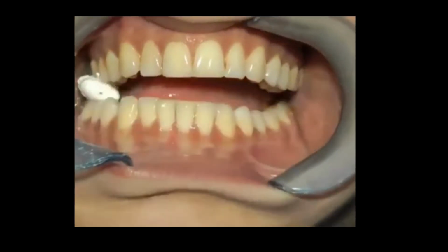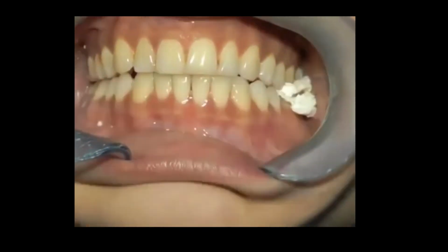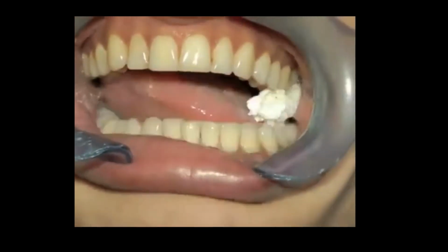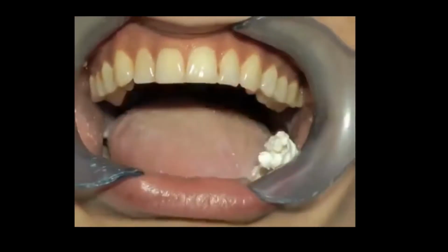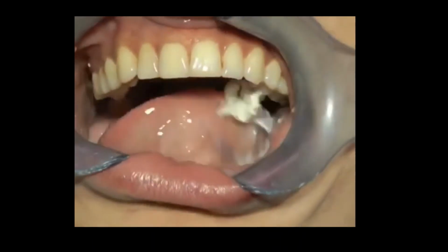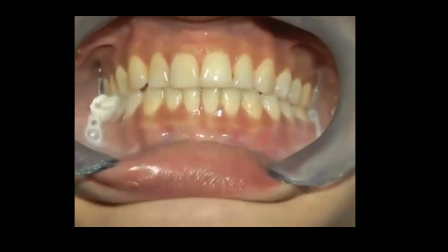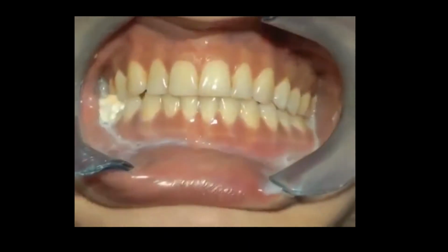And in this video, look at the rotation here. It's a little bit oval. You can actually see the freedom where they touch together, slide over, and then open. It's really dynamic here that you can see the freedom in Centric. And the teeth are designed with that motion in mind. That's how natural occlusion is, and that's how someone's going to chew with a denture.